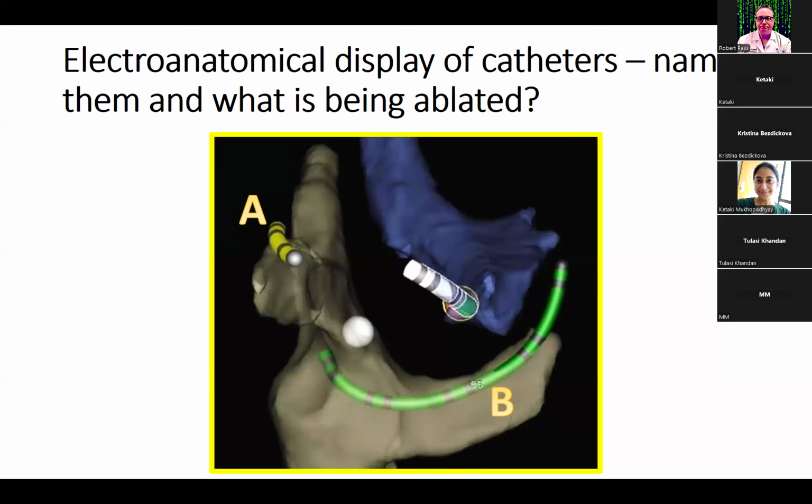So first of all, as you know, all of our catheters are what we call bidirectional, the ones that we use, meaning that there's a handle on it that will allow you to flex it down, as this catheter appears to be doing, or go the opposite way. And by the way, that's a relatively new invention. It's only been around for about 10 or 15 years. Previously, the original ablation catheters were fixed curve. So basically, it had no bend, no deflectability at all. So you had to be really, really good with moving sheaths around.